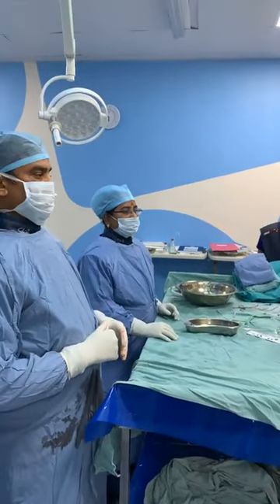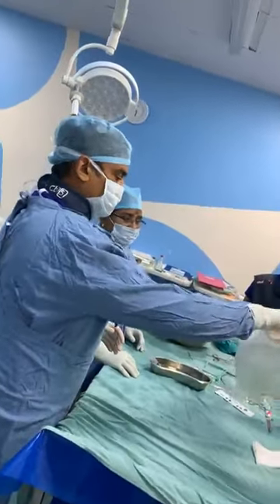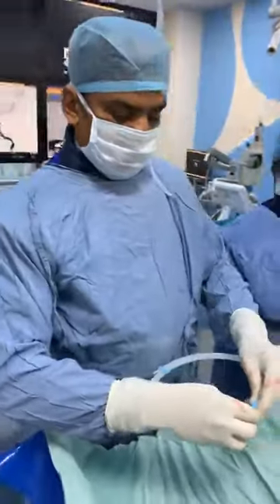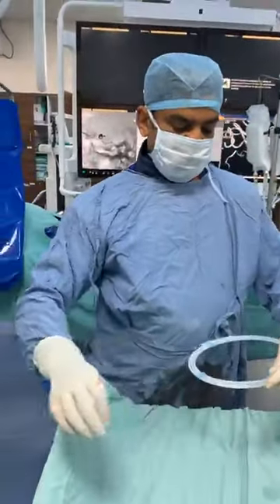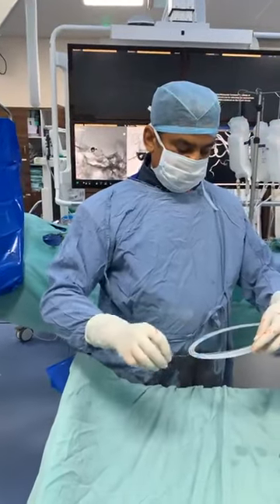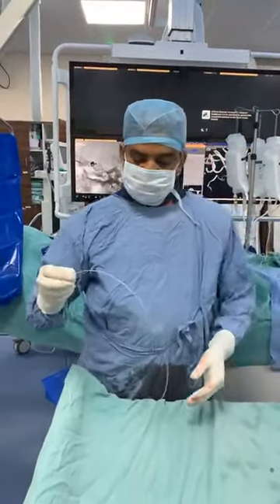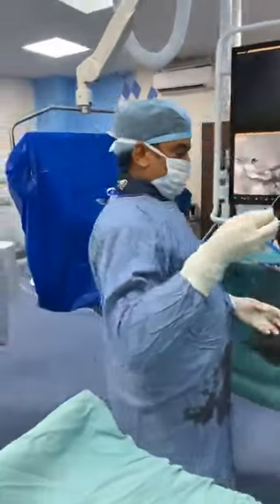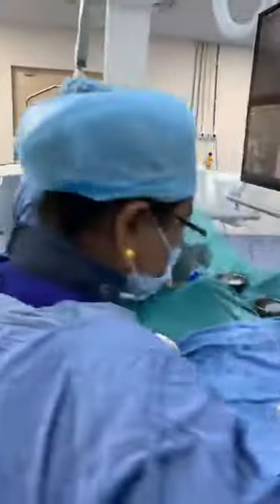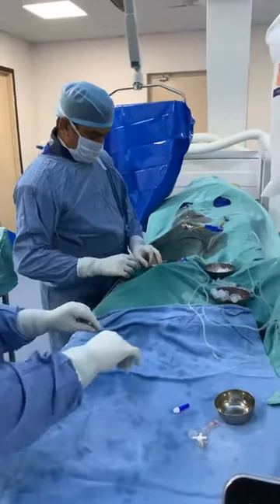And in case we need a scaffold for putting a device like a flow diverter, then we choose a braided stent. So you can put a braided stent and the flow diverter inside that at the same time. Or if you put a laser cut stent and there is a need to do a flow diverter, and if it is recent, then you can do a balloon angioplasty. But because it's a 2015 case, I will not do angioplasty.